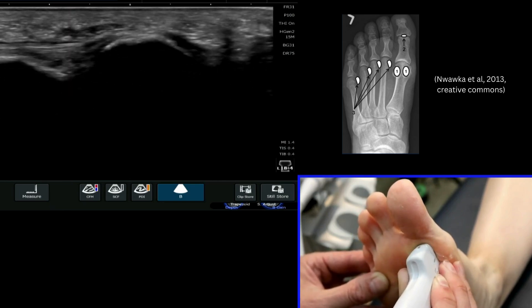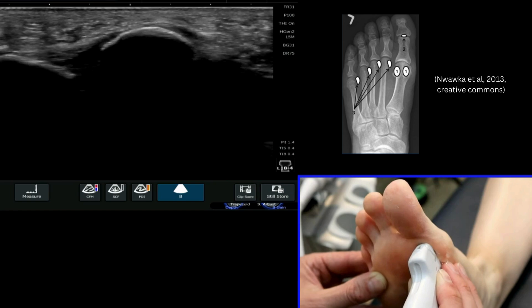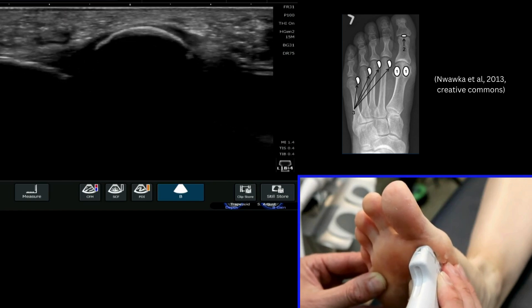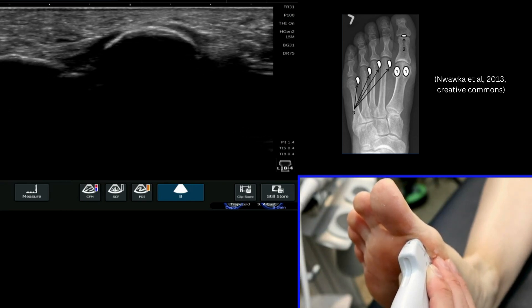These should be very clear, well-rounded, well-corticated structures consistent with a sesamoid bone. You can see that particularly nicely there with the medial sesamoid in this instance.